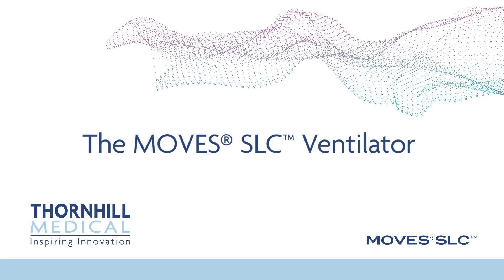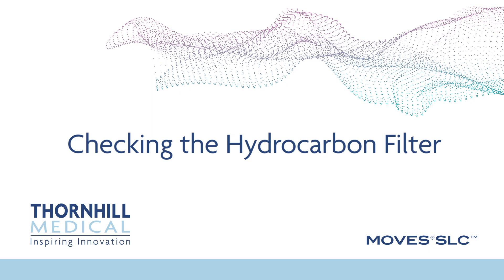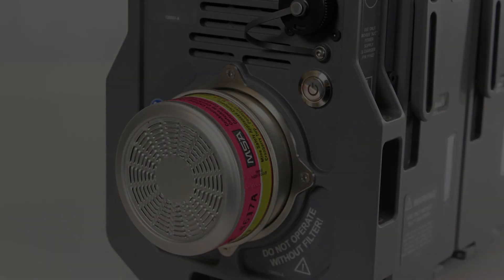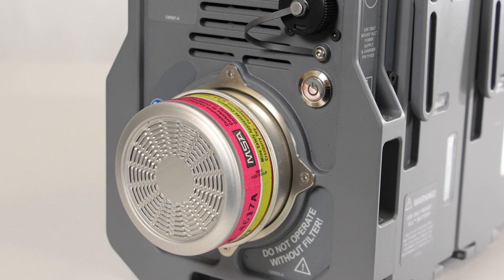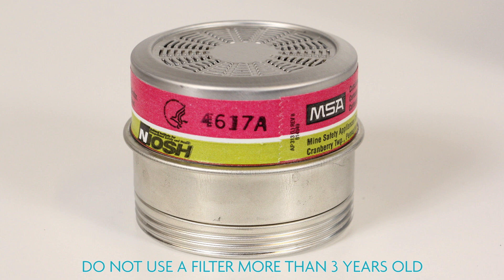The MOVES SLC ventilator. Checking the hydrocarbon filter. Before installing a hydrocarbon filter, check the four-digit date code printed on the cartridge. The cartridge label is stamped with four characters XXYY, where XX is the week of the year and YY is the year of manufacture. A cartridge more than three years old should be discarded since it may degrade performance or cause damage to the MOVES SLC oxygen concentrator.